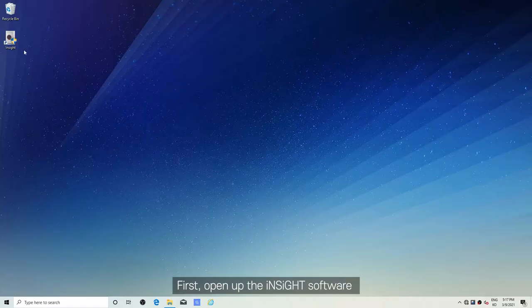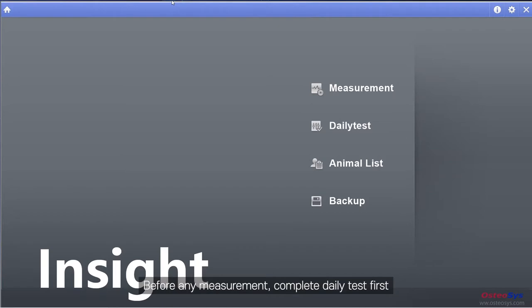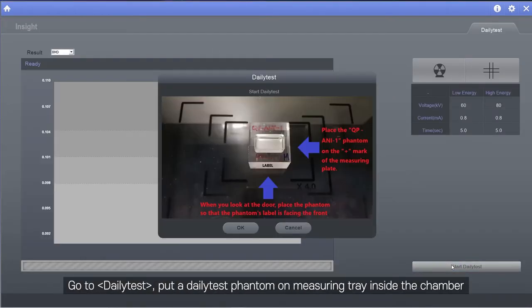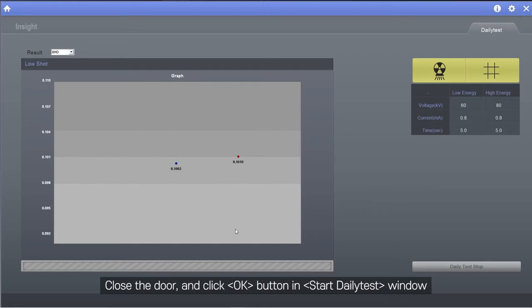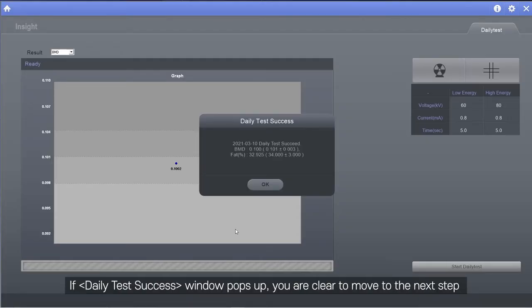First, open up the iNSiGHT software. Before any measurement, complete daily test first. Go to Daily Test. Put a daily test phantom on measuring tray inside the chamber. Make sure the label is facing front. Close the door and click OK button in Start Daily Test window. If Daily Test Success window pops up, you are clear to move to the next step.